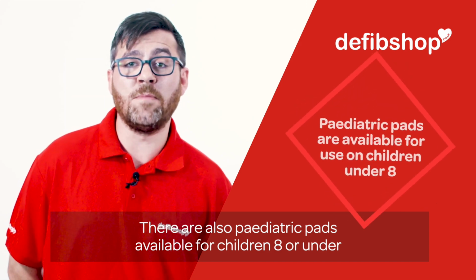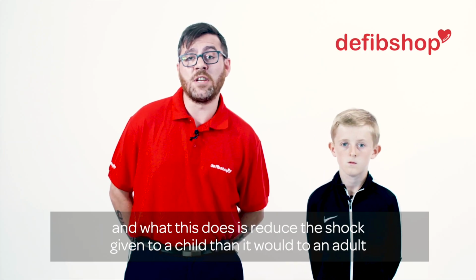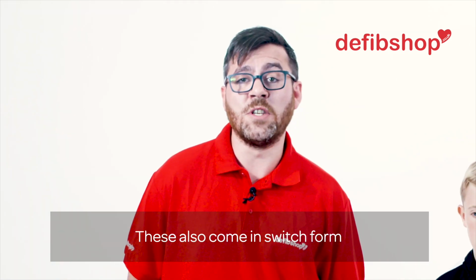There are also paediatric pads available for children 8 or under, and what this does is reduce the shock given to a child than it would to an adult. These also can come in switch form as well.